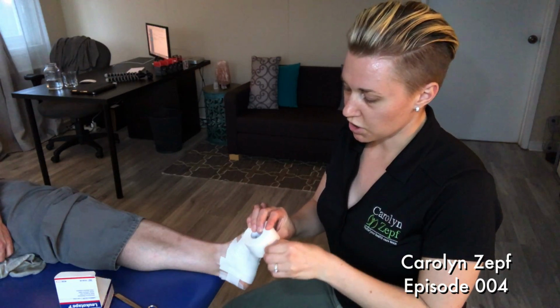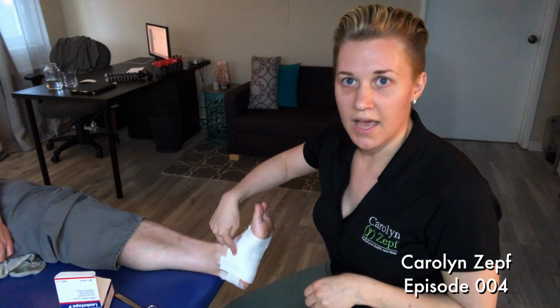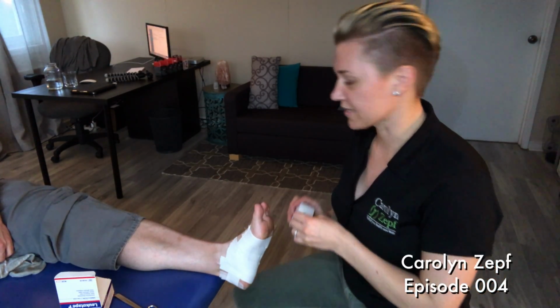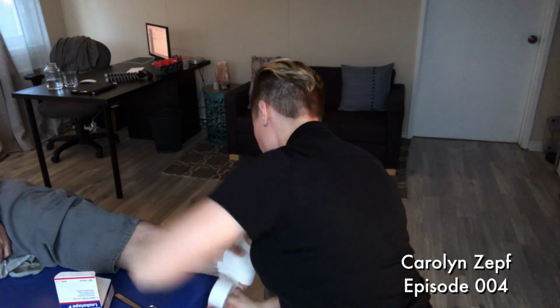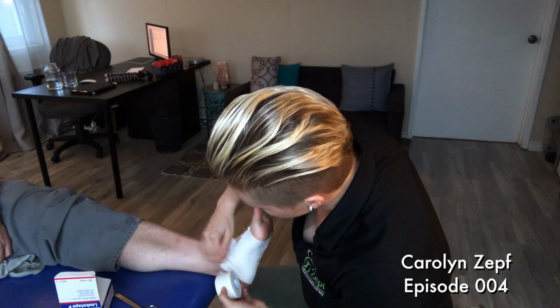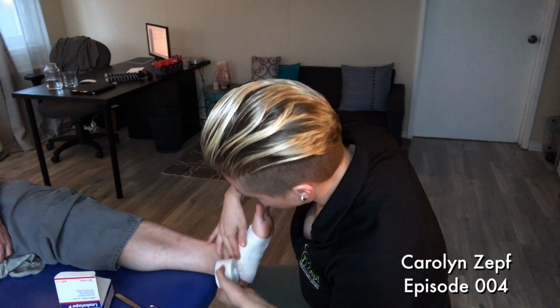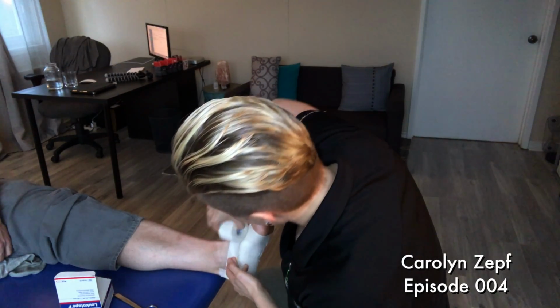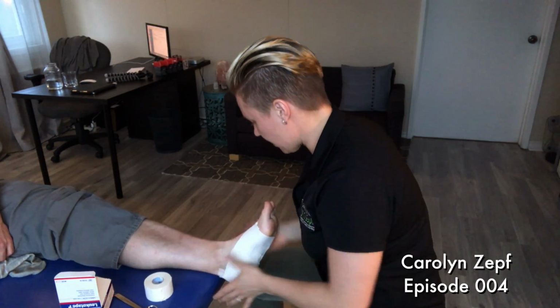All we're going to do is close up again with an anchor strip. Why? To make it look nice, and so the sides don't fray off and make your tape job less effective. So again, you start on the outside of the foot. You bring it up and across and around. Sometimes I bring the outside strips a little too high, so I just fold them down slightly. It's a little bit of a trick of the trade. Then I just bring it around and tuck them in so they look all nice. Tear, smooth it down, just make sure everything's in and nice.